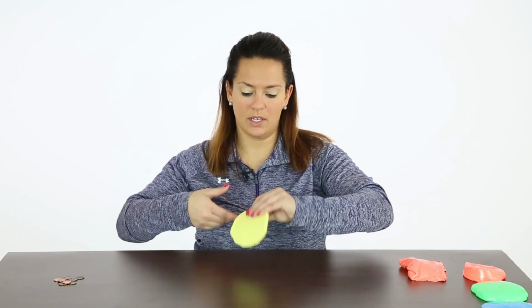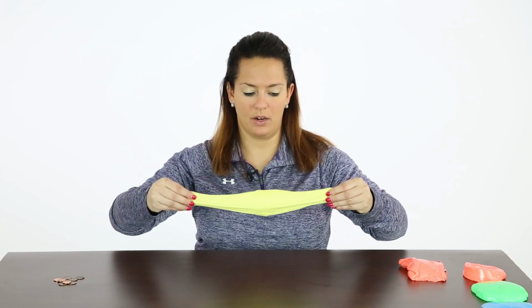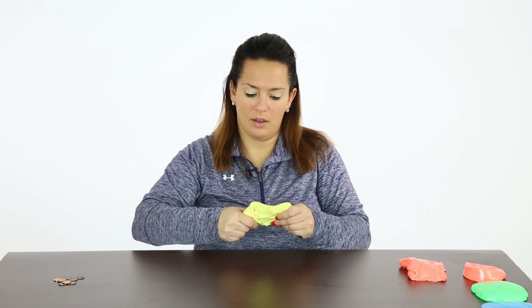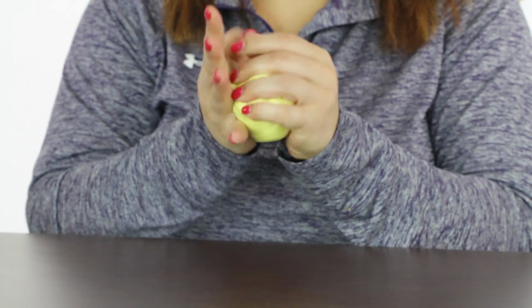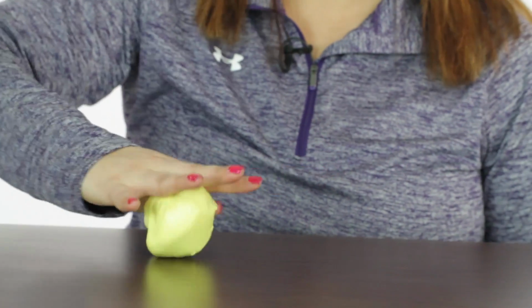So we're going to start with the yellow extra soft putty. It's fairly easy to pull apart. It has the least resistance of the Theraputties. This would be a good place to start with clients. You can use it with two hands to kind of pinch, roll into a ball. Two hands, use it on the table if you have decreased use of one hand.